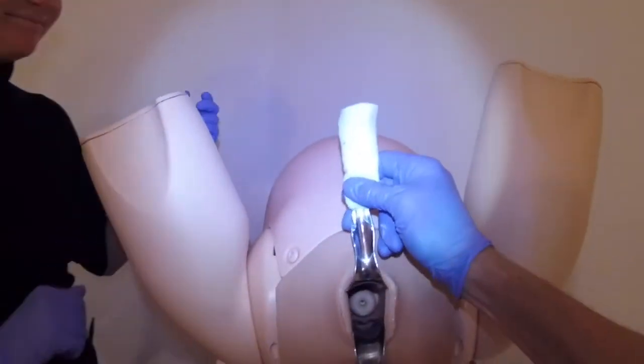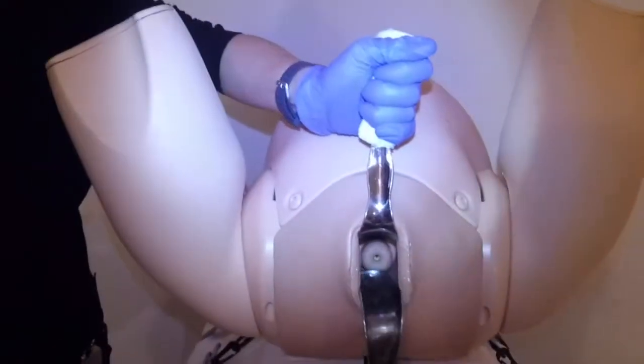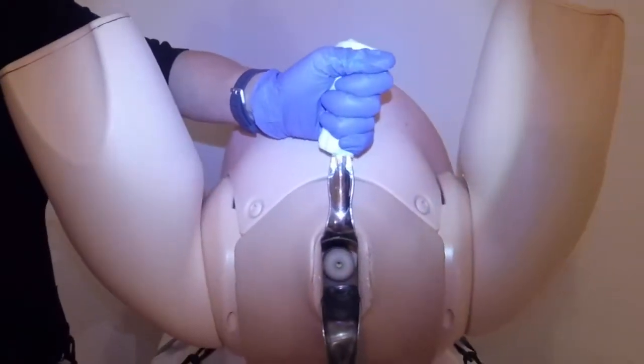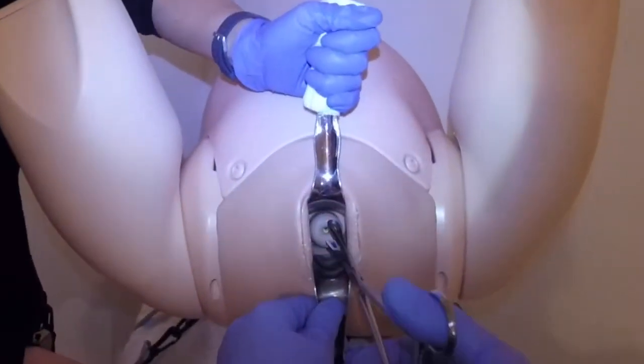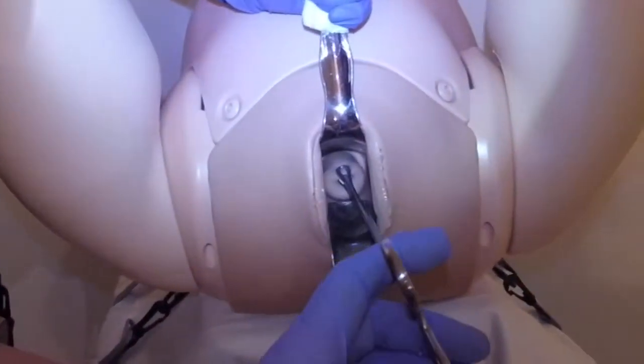Daisy has already been briefed. If you could take the speculum and the sidewall retractor there — we have already had a conversation, as I would with my normal assistant, about positions of these instruments with respect to the clock.